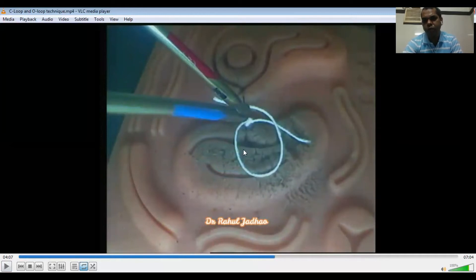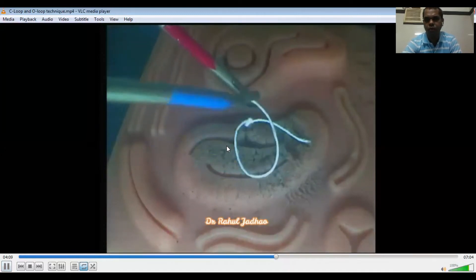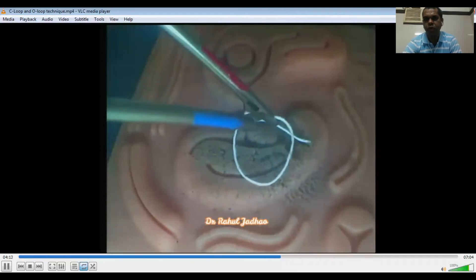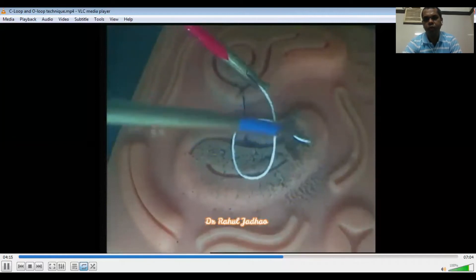Now I will be demonstrating the over wrap. For over wrap, the left needle holder should come from above. And now for over wrap, we have to do supination of the left needle holder. This is the supination of the left needle holder, and now the loop is made.